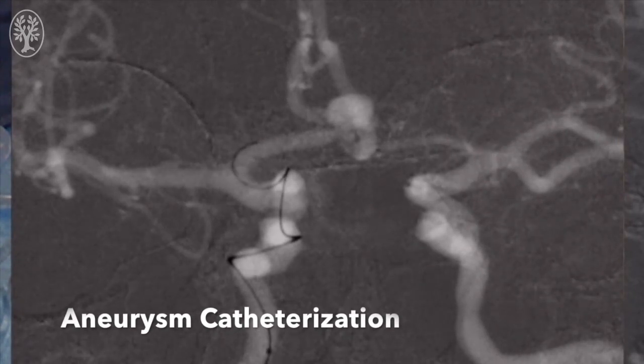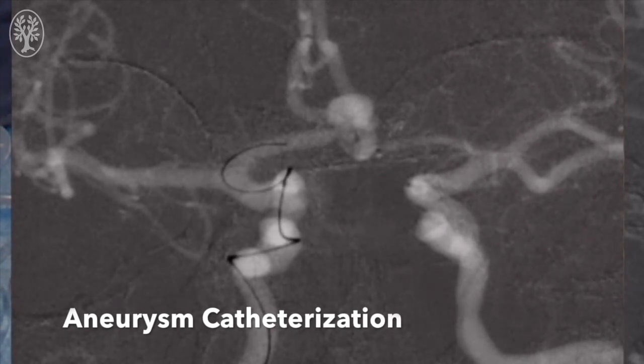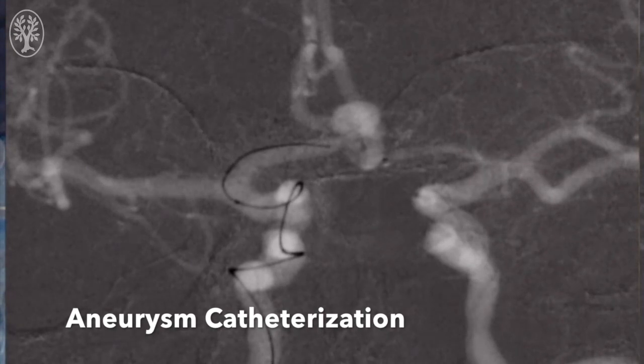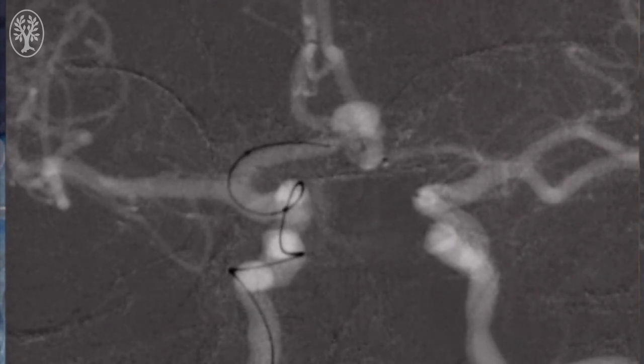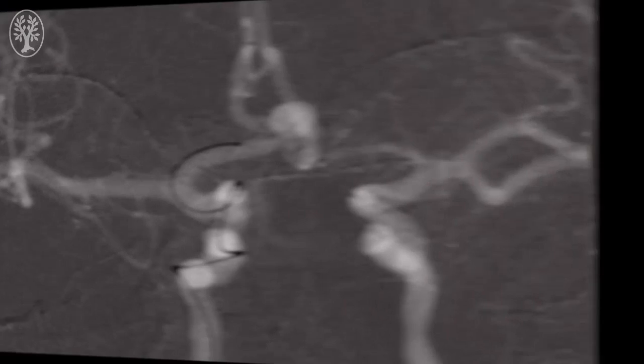As the wire is navigated into the A1 segment on the right side, we carefully navigate the microcatheter along the wire, as can be shown here. Typically, we may shut off the flush so we can develop friction between the wire and the microcatheter and use a push-pull technique, and as we pull the wire, we can drag the microcatheter up along the wire into the A1 segment.